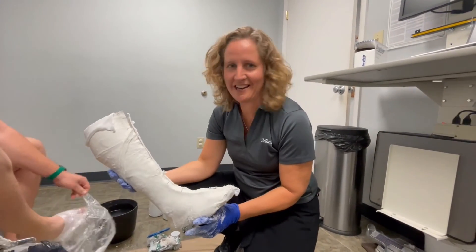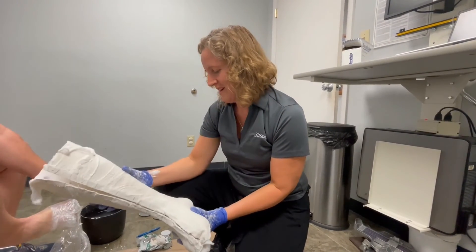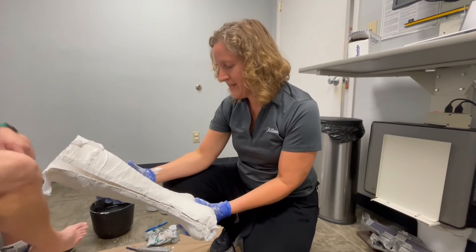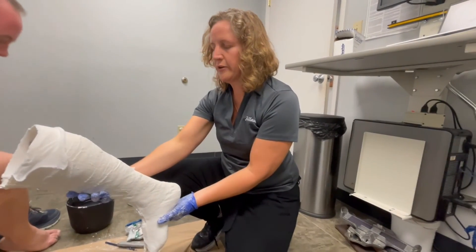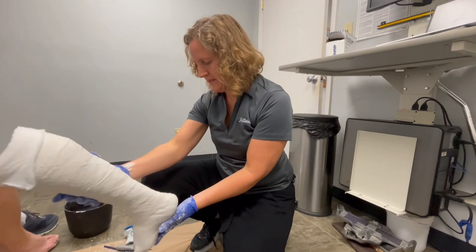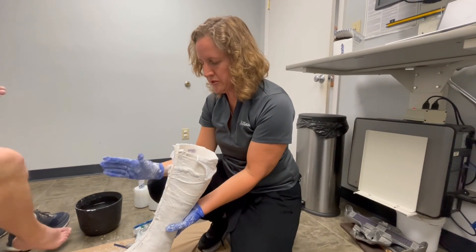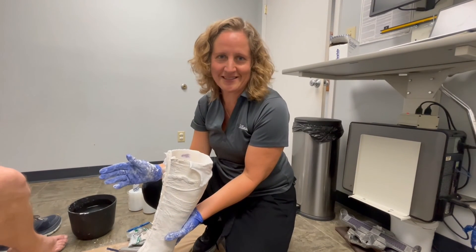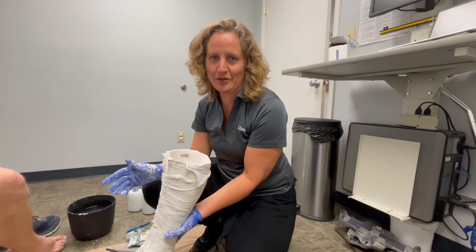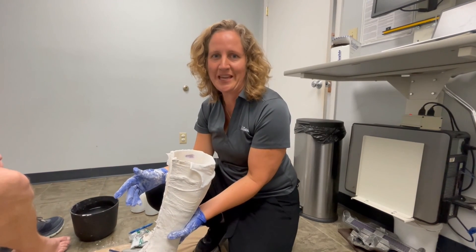Now we're done with casting. I need to check my cast and verify it's in the correct angles. I look in the sagittal plane to see it's around 90 degrees, check the frontal plane to confirm it's neutral, and also the transverse plane. If it's not correct, make a new cast — it's extremely important for us to receive a good cast in order to make a good brace for your patient.